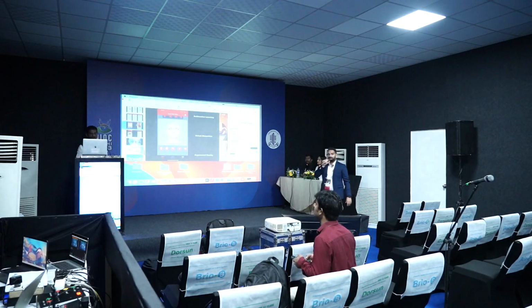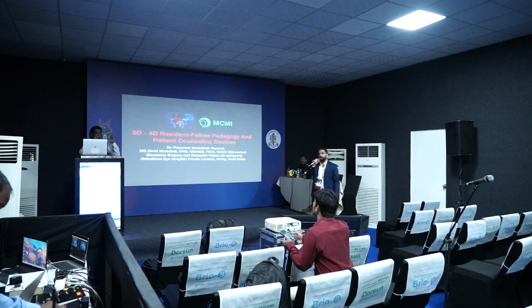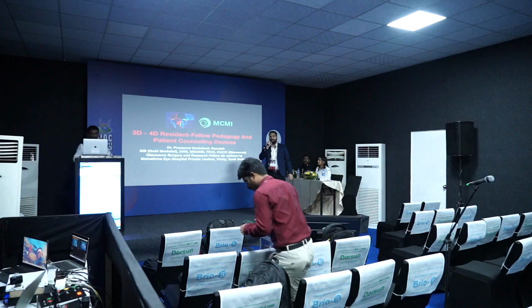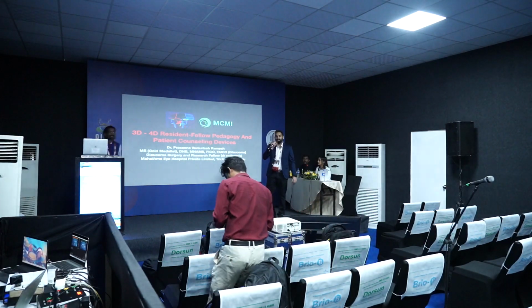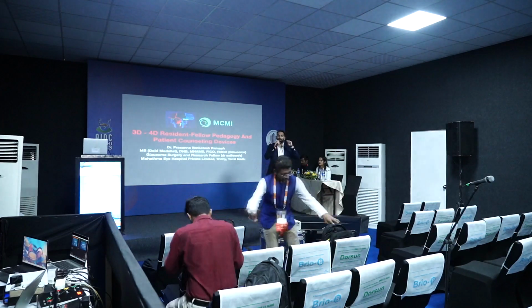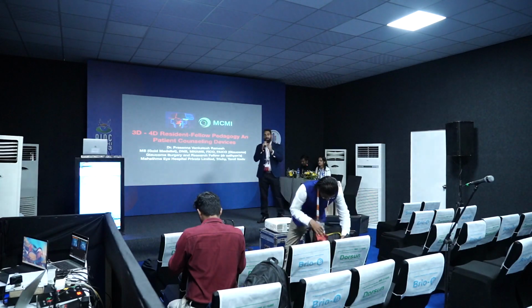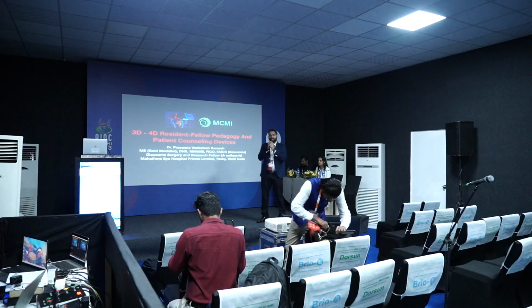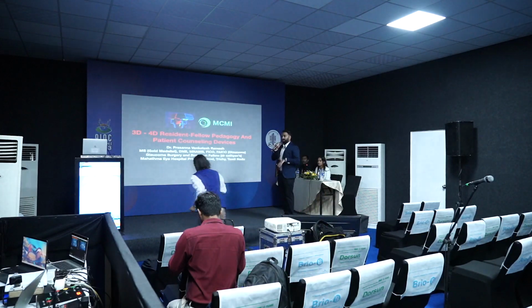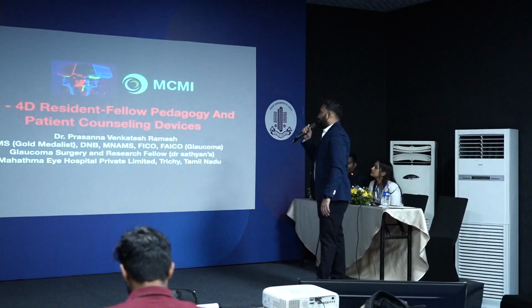So we are going to start our instruction course on the Smart Eye Clinic. Basically, it's based on how ophthalmologists can use their smartphone in their daily practice to take images, to calculate their IOL power or do a measurement of the visual acuity or any of those things, and how all our instruments can be used for patient counseling. So initially we have Dr. Prasanna Venkatesh Ramesh for his 3D 4D resident fellow pedagogy.